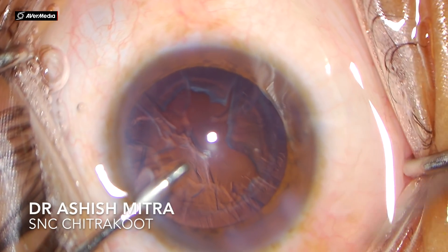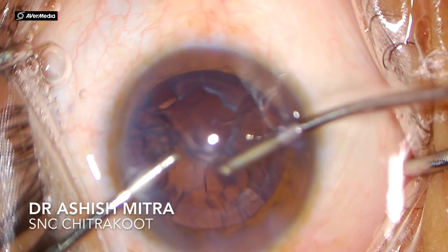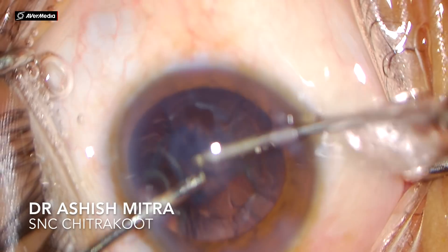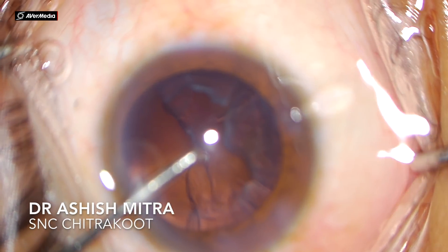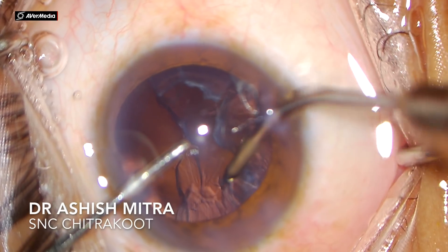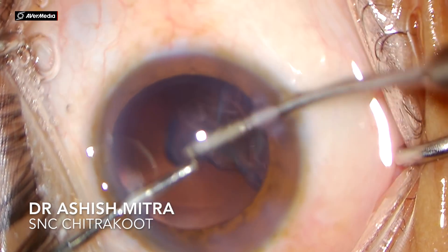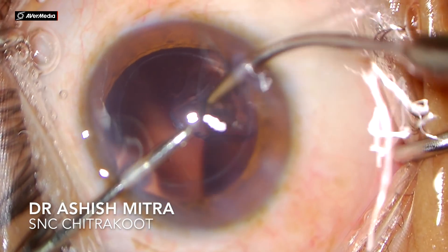I will be aspirating the cortical material with my irrigation and aspiration cannula. This is the bimanual irrigation and aspiration system, where you maintain your irrigation cannula in place and with your aspiration cannula you peel those cortical pieces towards the center and then aspirate. If you are catching the capsule you will feel resistance. If you have an intact rhexis, the chances of the capsule getting caught into the aspiration cannula are minimal, and whatever you are holding is probably the cortex.